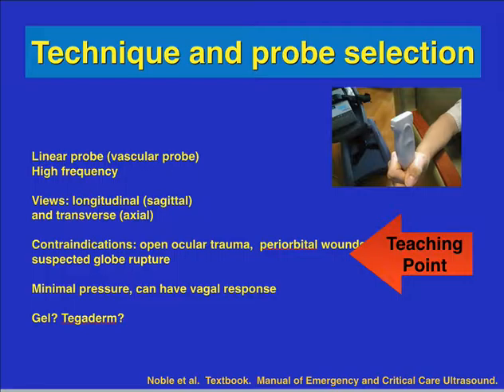And the question is whether you should use gel or Tegaderm. My general experience with Tegaderm is that when you use it, it's almost harder to get off. Some of the older patients that you're going to be using it on have really sticky skin, and it makes it almost elastic and hard to get off. It does save the patient from having a lot of gel, but honestly, you really don't need to use a lot of gel.